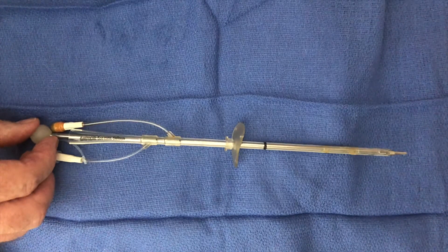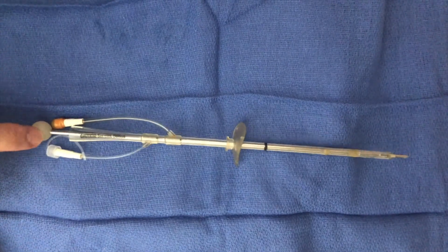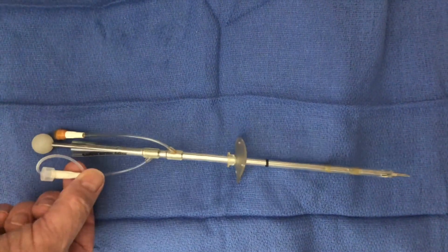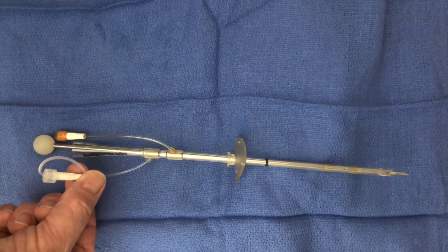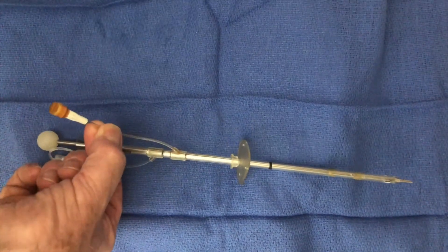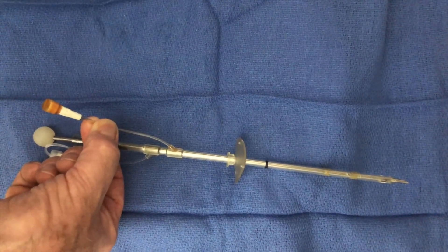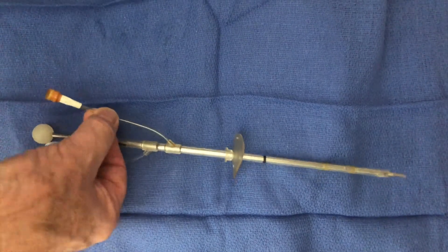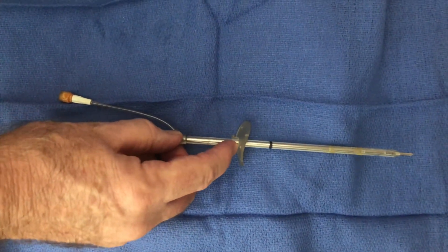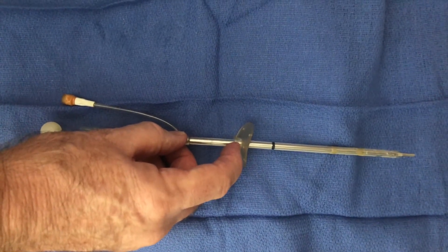This is an Argyle Ingram suprapubic catheter. It has a trocar, a port for taking samples, and an inflation port for the balloon. This requires a needle and 5ml of water. There's a flange which can be sutured to the skin once the suprapubic catheter is inserted.